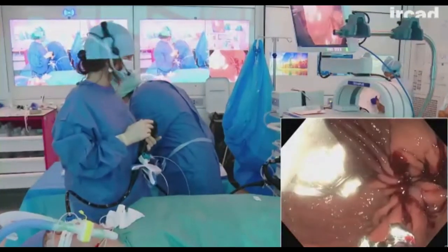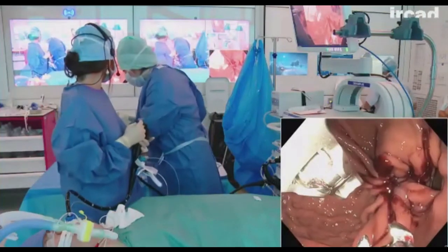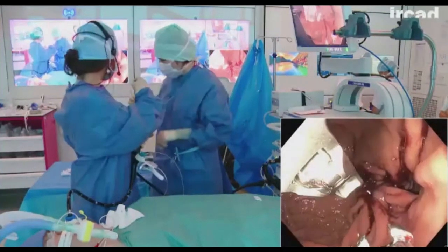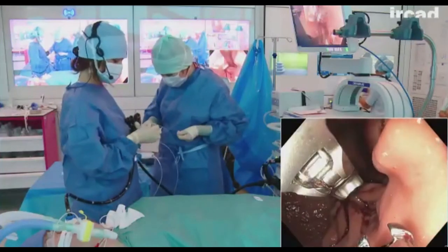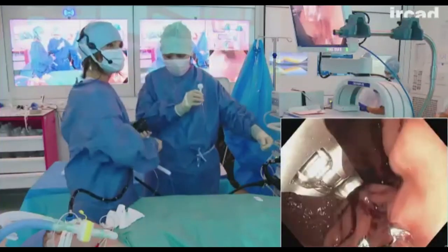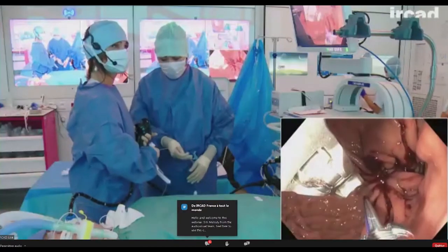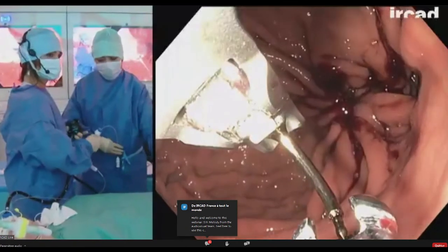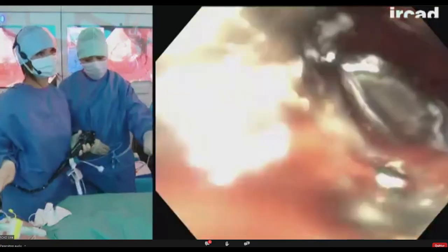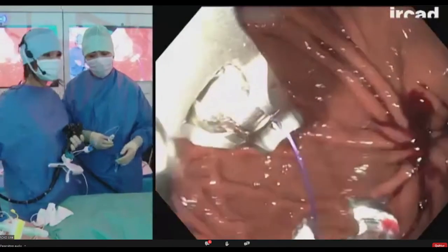As you are cleaning and preparing, we got some questions from the audience here that are very good ones. So the weight loss is the same as bypass? Also, will the procedure impair the possibility of any bariatric procedures in the future? And the learning curve. So I can start answering. That's not the same weight loss of a bypass. We are targeting 15% or up to 20% of total weight loss. It's not gonna impair the possibility of a new bariatric procedure. You can do a sleeve, you can do a bypass. In the learning curve, Silvana, I leave it up to you because we otherwise are gonna be biased.